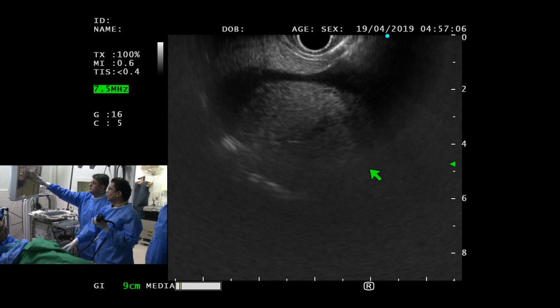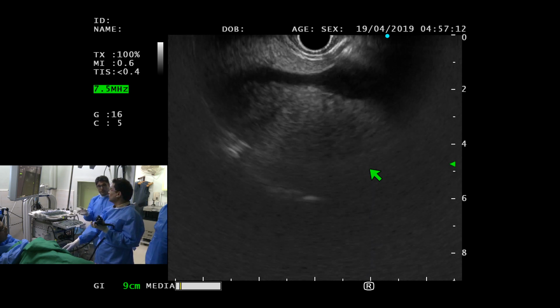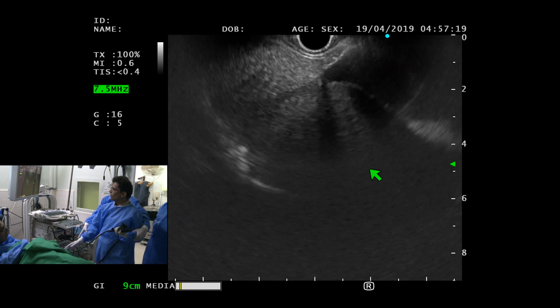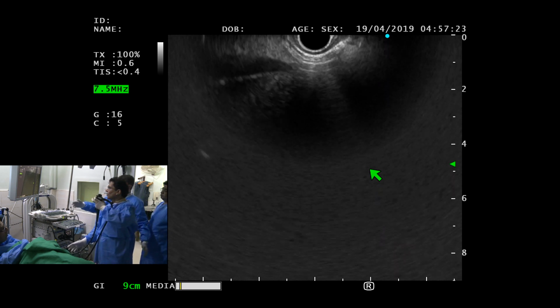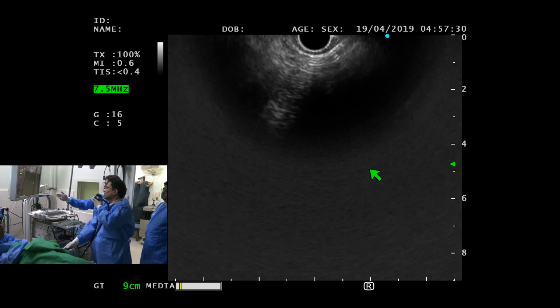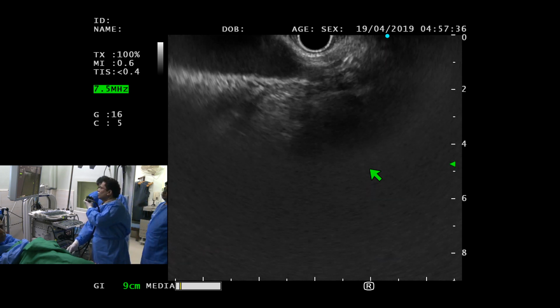Yeah, that's it. So this is the hepatic vein, and you can actually see the IVC. You can actually see the heart pressure on. Okay, so at this point we know our plane is right. All you need to do, stand a little behind, so this will be easy for you, and give space to your left arm as well. And now you just keep going, as if by magic, and you should have the aorta come in front of you. You're at the right plane because we saw the IVC on the way. Keep going. That's it. Okay.